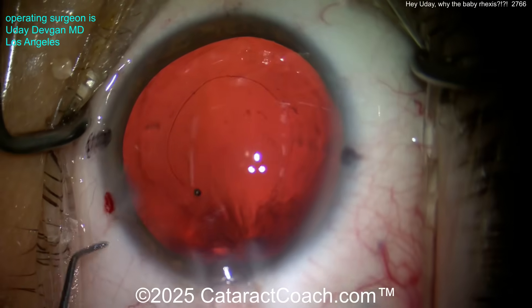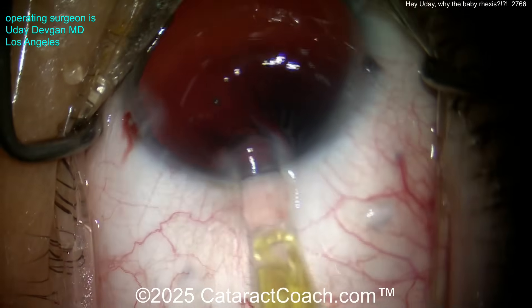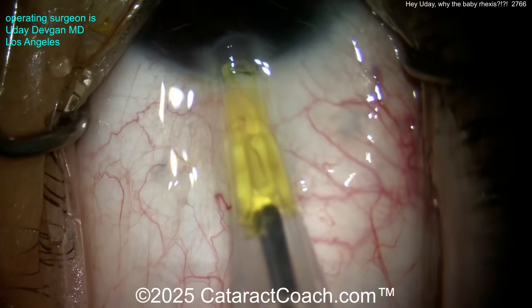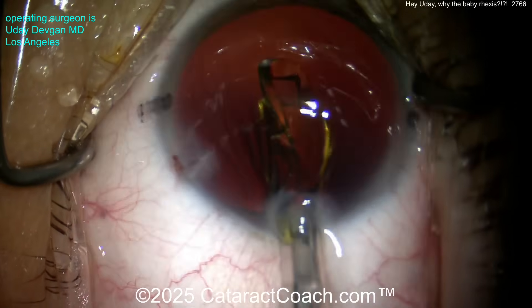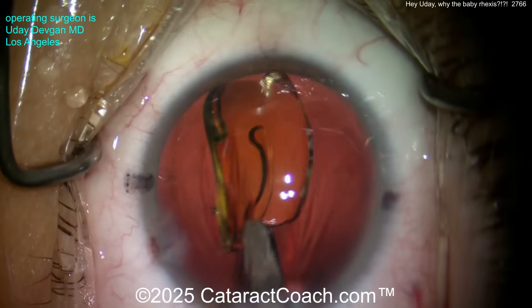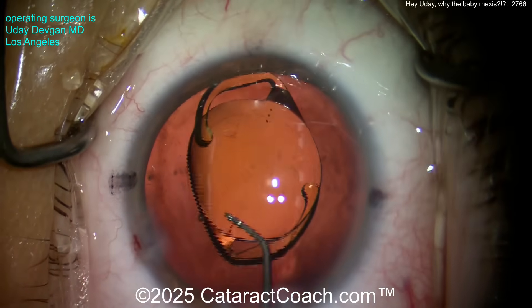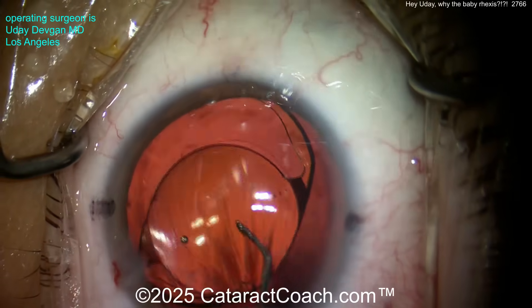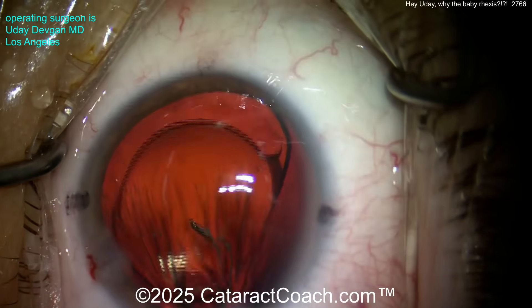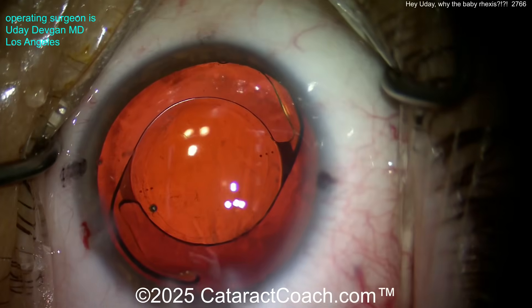Here comes the lens — the moment of truth. It's a single-piece acrylic lens. Now why is the AC kind of soft? Think about it: you needed the full syringe of dispersive to fill the eye at the start of the case, and we used part of the cohesive for the injector. I could have opened another viscoelastic but I didn't think it was necessary. Here comes the lens — there's the 6-millimeter optic, and you can already see the rhexis. Boom — on the money, 5.5.